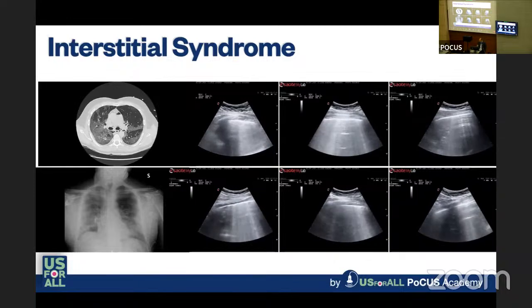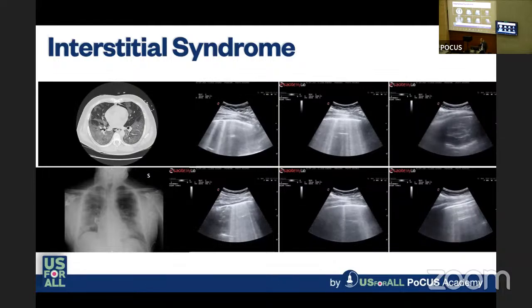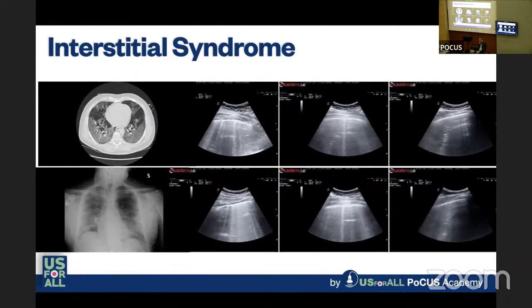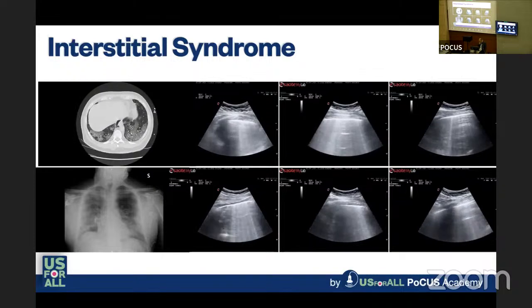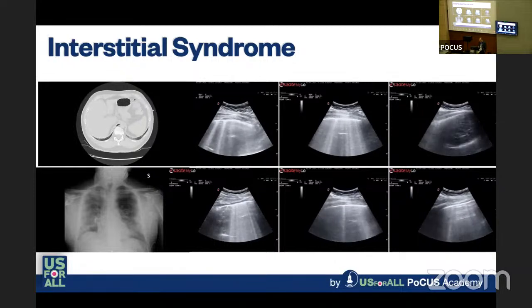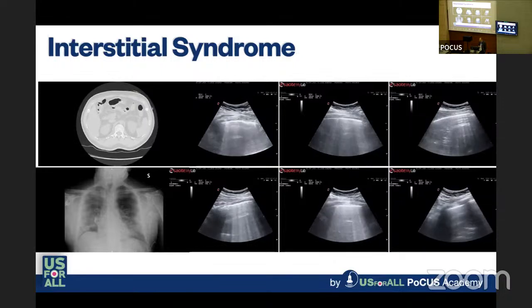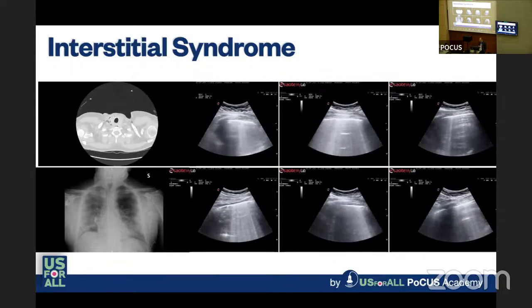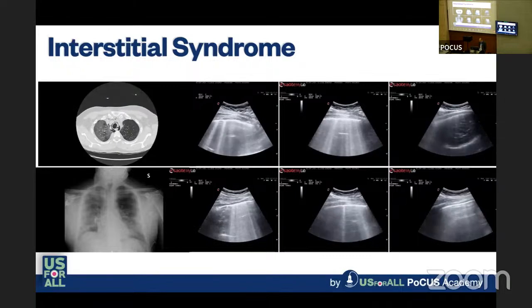Здесь вы можете увидеть пациента с COVID-19, и здесь другая картина B-линий. B-линии неоднородные, они имеются не по всей поверхности легочной ткани, а имеют прерывистый паттерн. То есть есть B-линии и есть участки нормального легкого, и они чередуются. Если бы мы не знали эту информацию, мы могли бы перепутать COVID-19 с фиброзом.